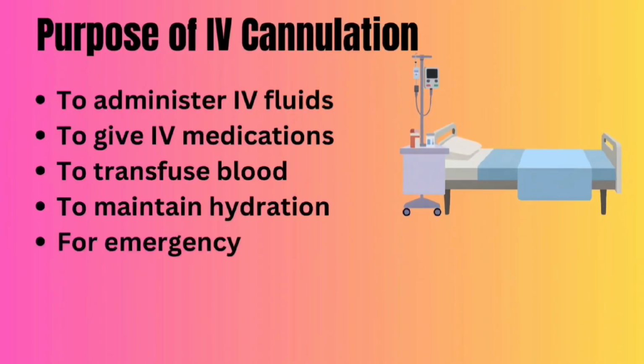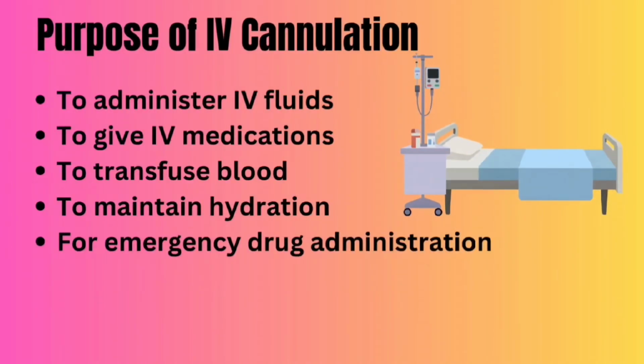Next is the purpose of IV cannulation. Why do we use IV cannulation? To administer IV fluids, to give IV medications, to transfuse blood, to maintain hydration, and for emergency drug administration. For all this we need IV cannulation for those patients who need long-term treatment.